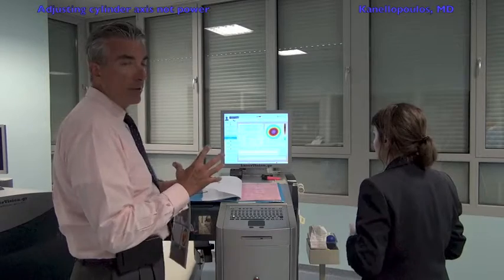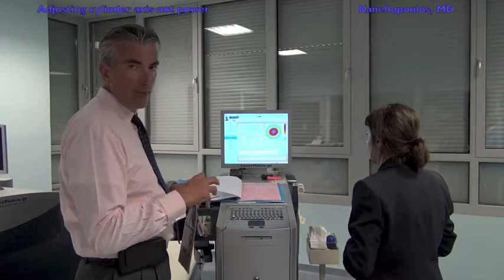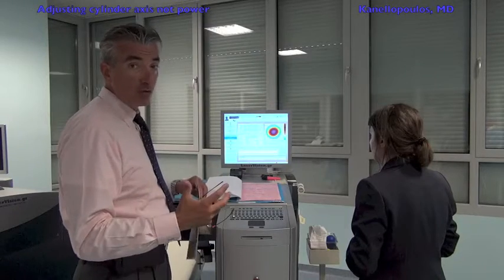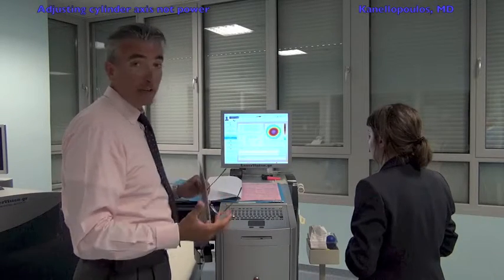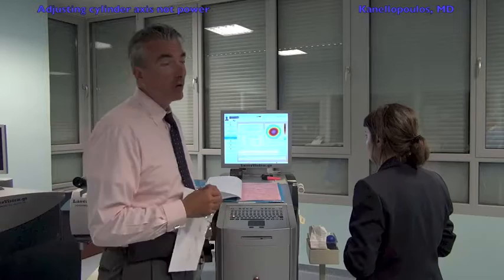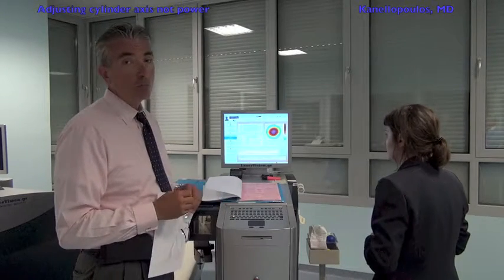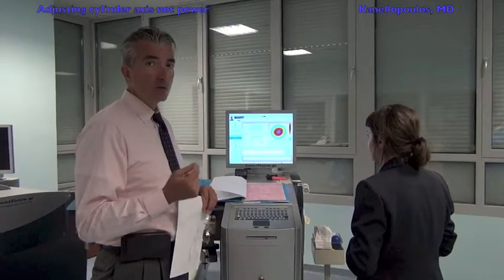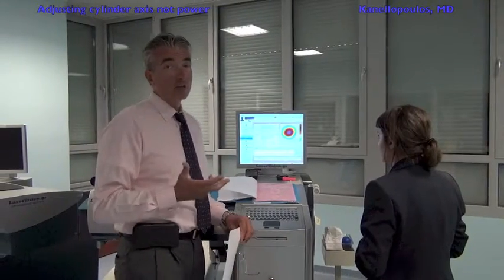We'll see how we have incorporated topography-derived data in order to change what I was trained over 20 years ago, and what is currently practiced globally as the golden standard for refraction used in laser corrections.